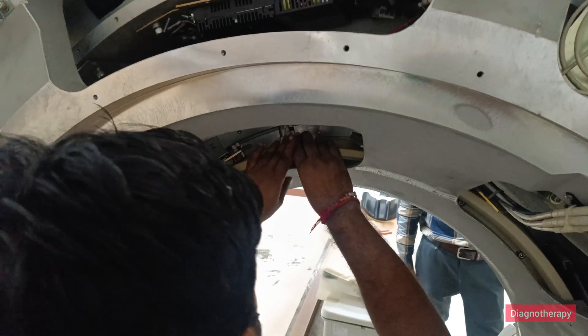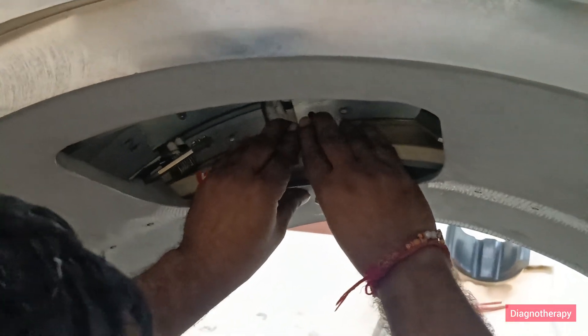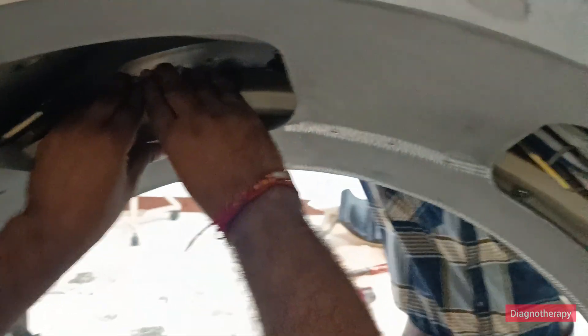As a basic service procedure, here we are cleaning the slip rings for proper communication and power transmission. We are checking all the slip rings, viewing their condition, and inspecting for any wear and tear.